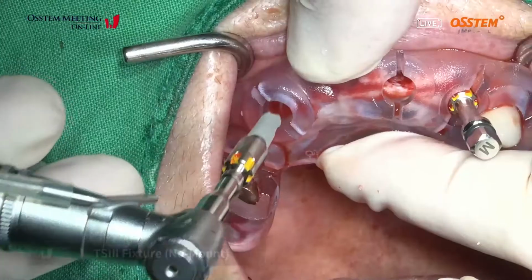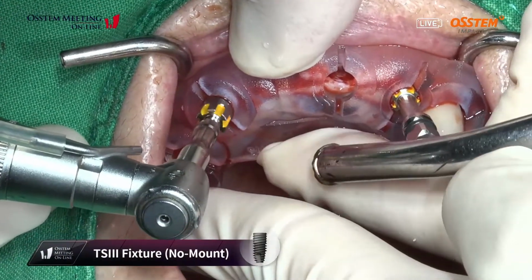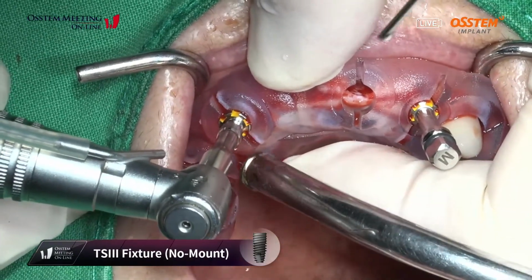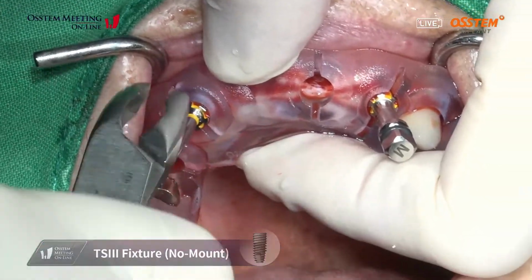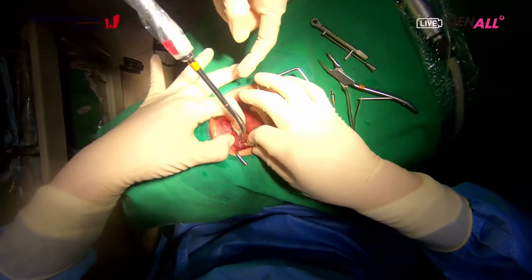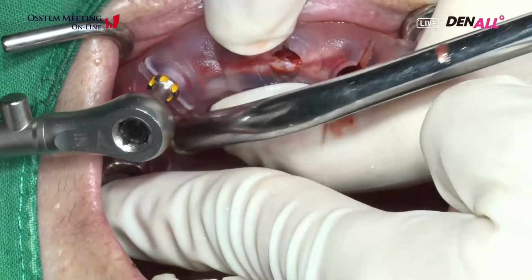One more 3.5 by 10 in the right canine. Okay, depth control.